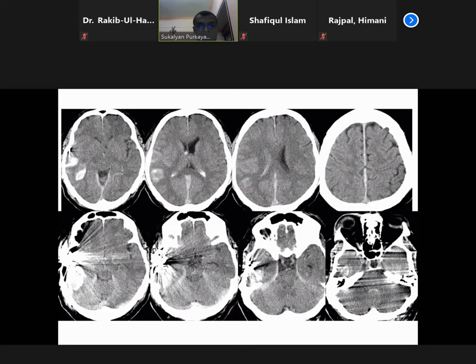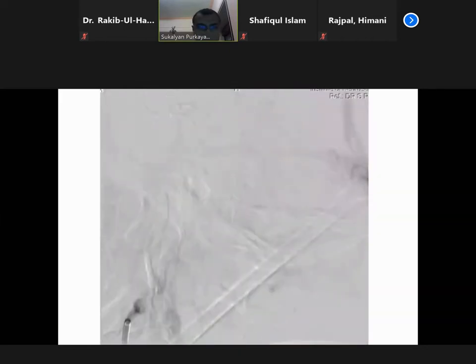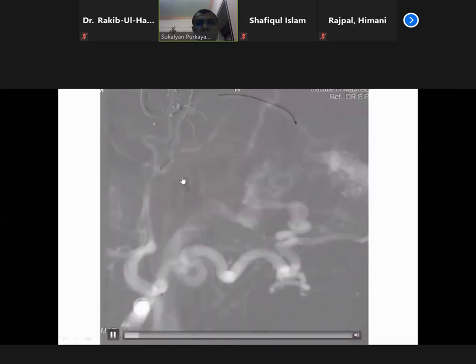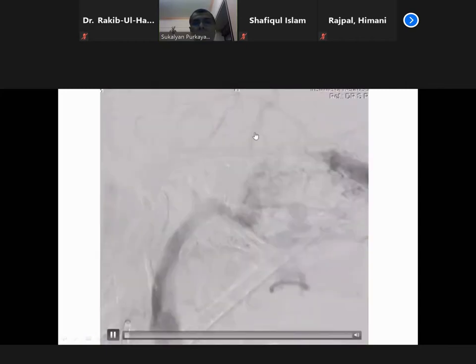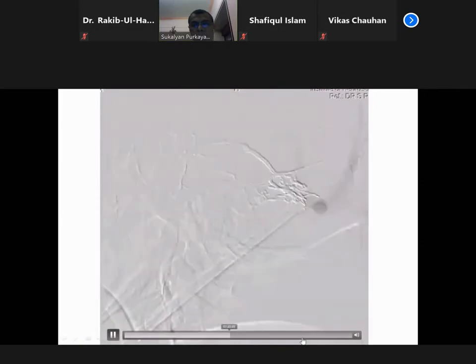The posterior fistula again, because if you do not block the posterior fistula, you will not be cured. Now, I just kept it for the beginners, just to make you understand how you negotiate. So we have gone through a bit of tortuosity into the middle meningeal artery, went there, then blocked. For want of time, I will go a bit faster.